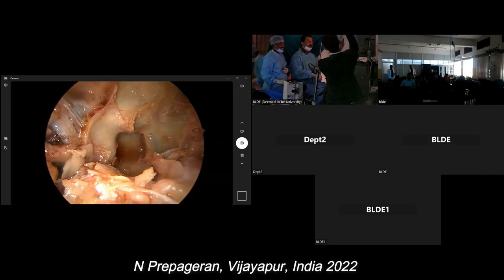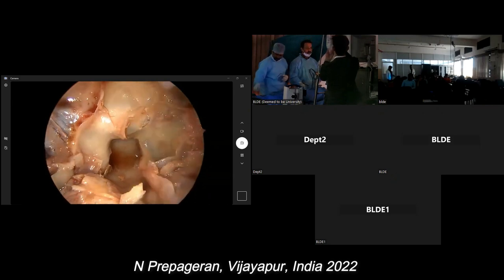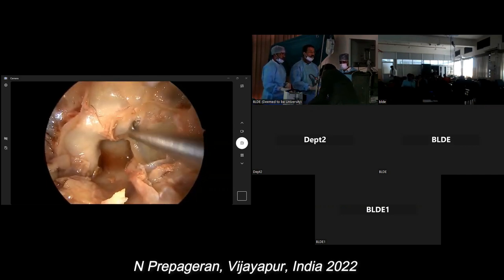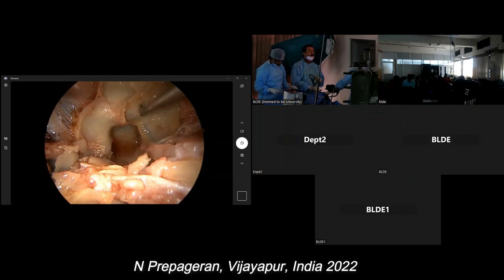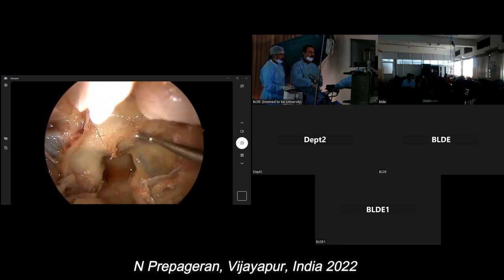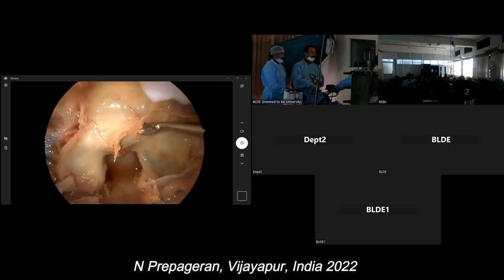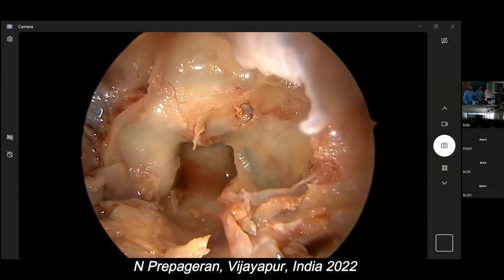Curette. I think better use the curette. So I'm just going to remove this bone. Okay, that's fine. Let's go. I just need some space. Remember, careful of the scope. Okay, guys, punch. Enough space, I think. We'll find out soon.